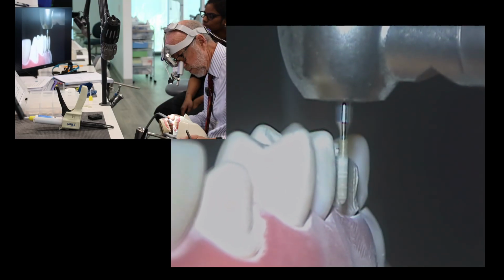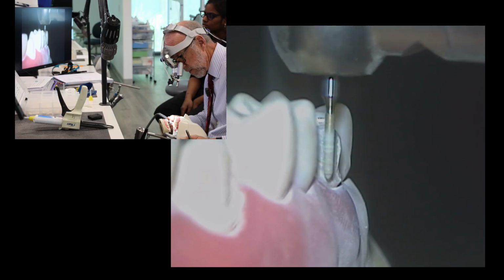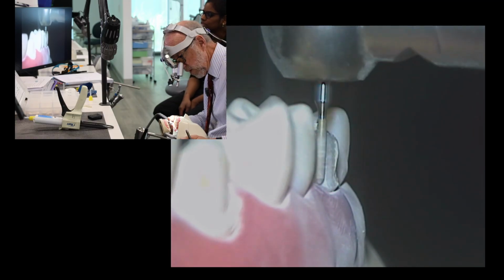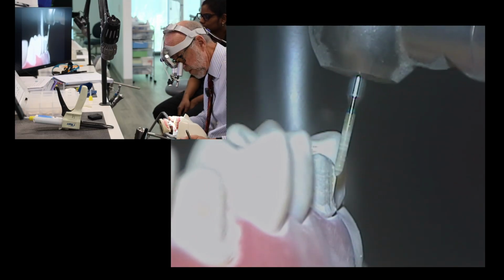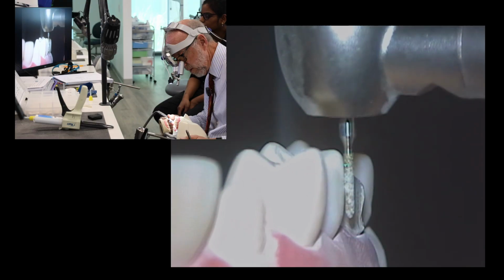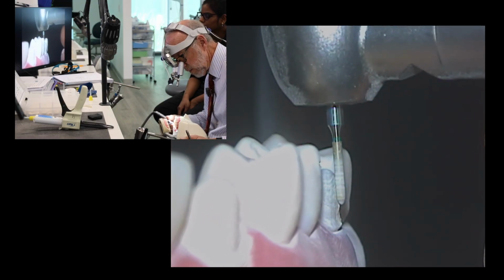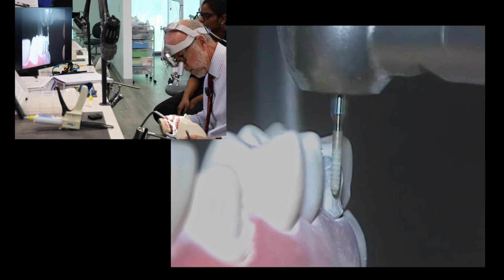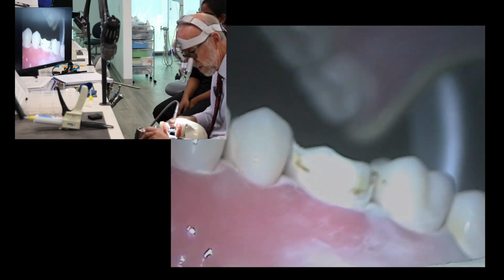But again, double check, triple check that taper. Once you find the taper, lock it in and use only that taper. And then reduce until you see the end of the burr at the margin right there. So you see there's a little bit under reduction there. Secondary plane would be matching the angle of the incisal third here. Okay, so 2/3 like this, 1/3 like that, and you can take care of matching the distal side to the mesial side.